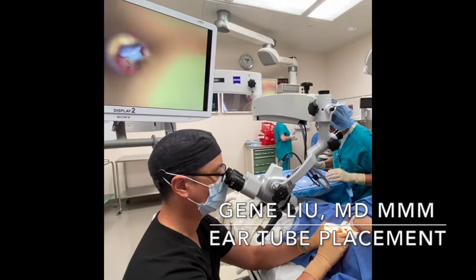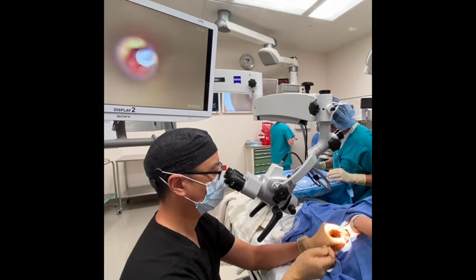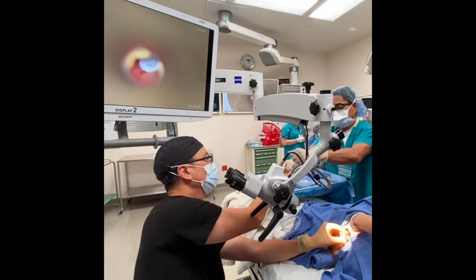This video shows how we place ear tubes in children in the operating room. The procedure is exactly the same for adults, but most of the time adults can tolerate this awake sitting up in the office.